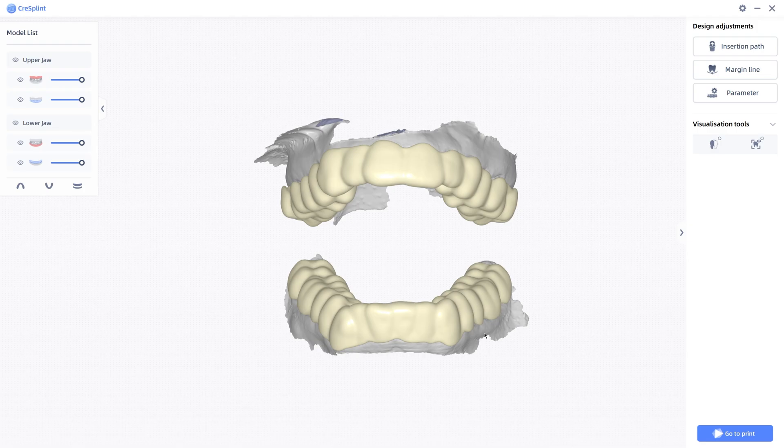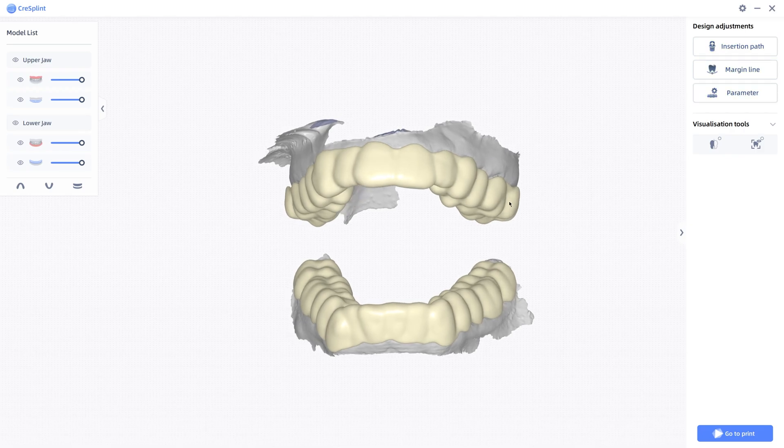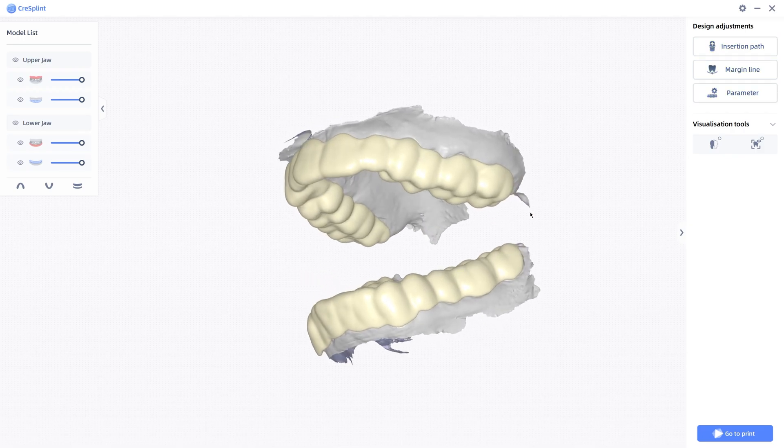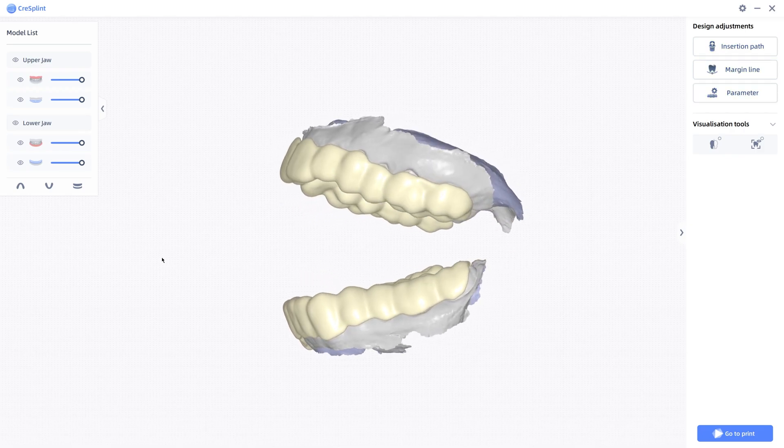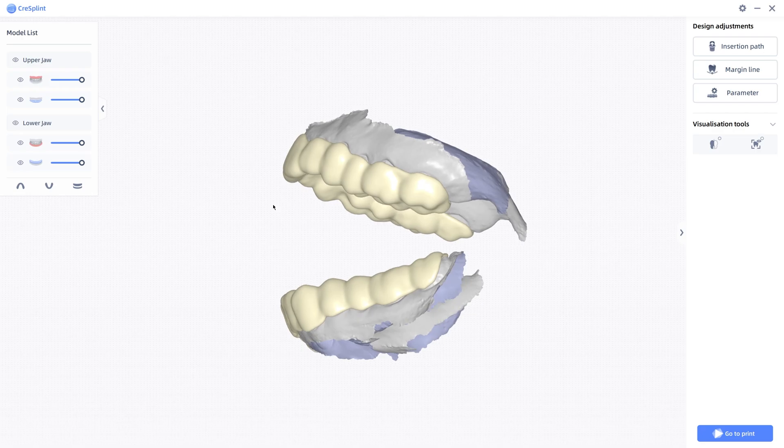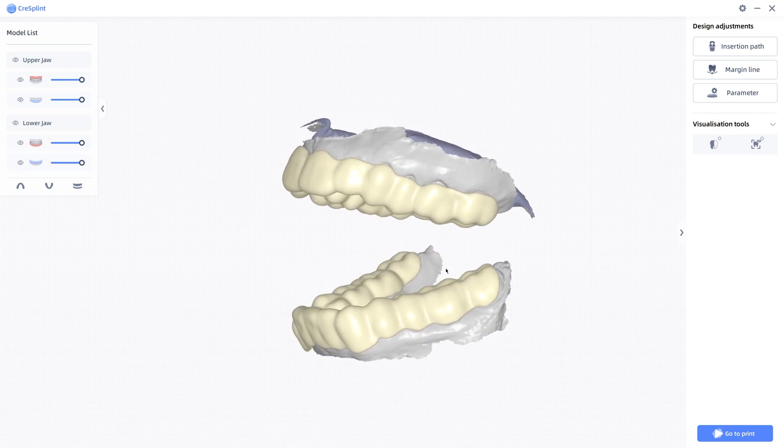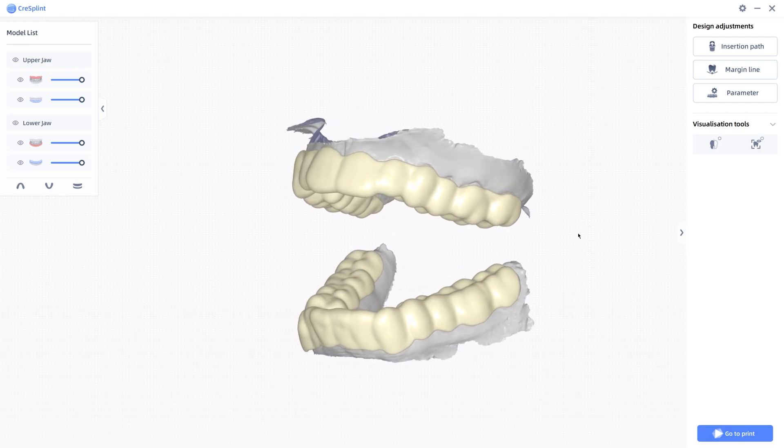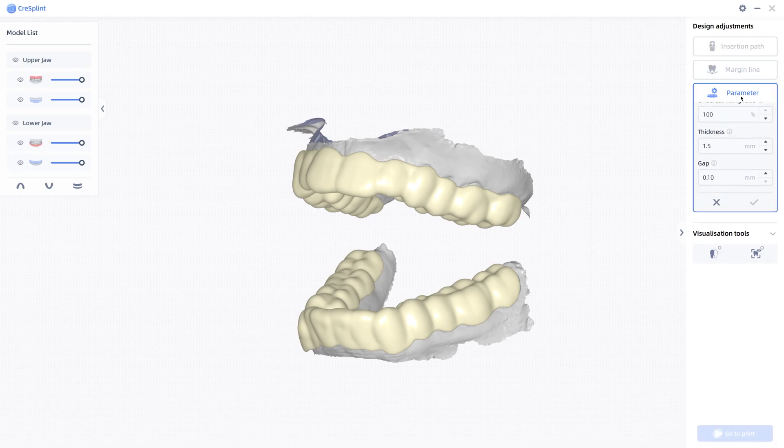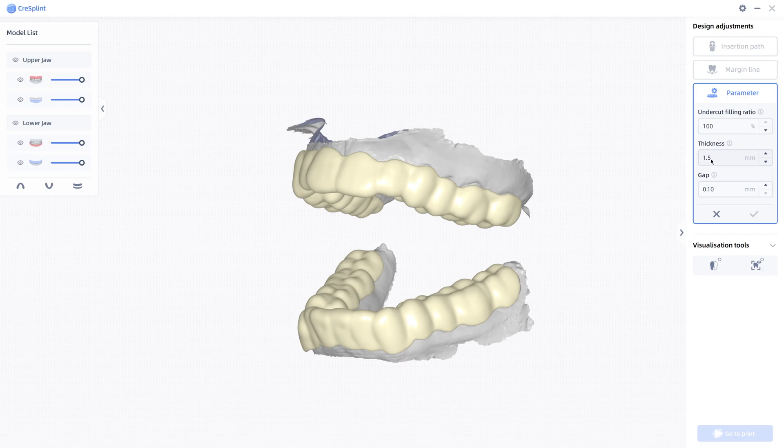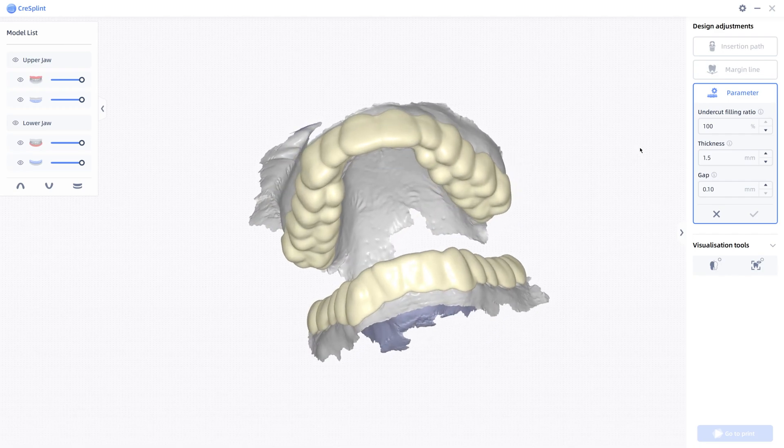So you see it generated both upper and lower bite splint. You can mess around with anything here if you want to adjust it, but I found it usually does a great job just on its own without messing around with any of the parameters. You can adjust the thickness of it. Like BlueSkyPlan aims for like a 3mm thickness. 1.5mm works pretty good with the Keystone software.